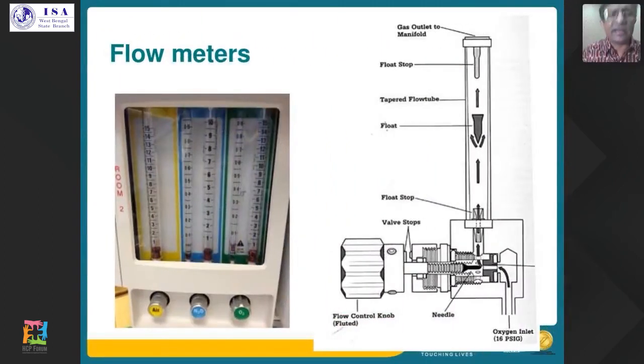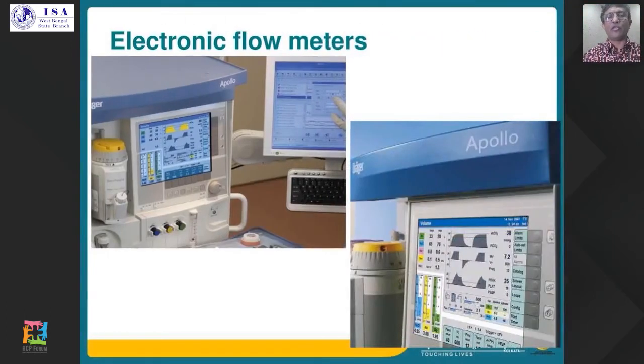These are about flowmeters, and these are the electronic flowmeters that they look like.